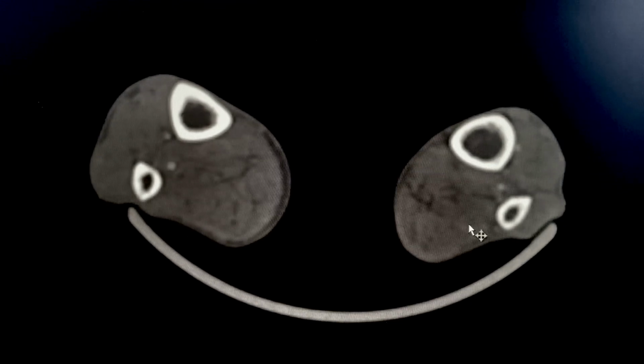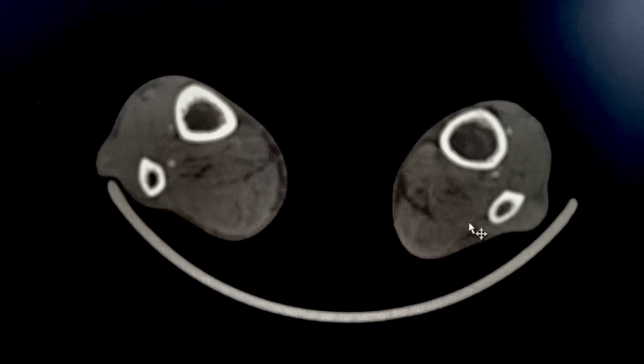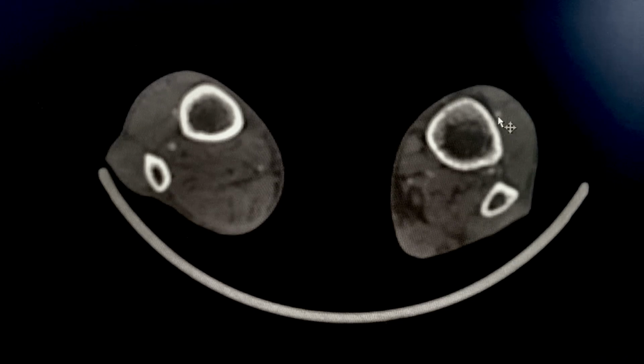All right, and continue. On the left, you can see that now you have a collateral that feeds into the posterior, while the anterior and the peroneal arteries remain also patent there.